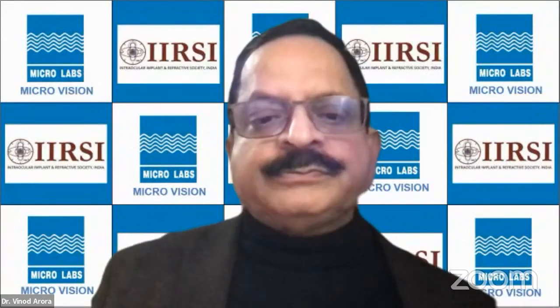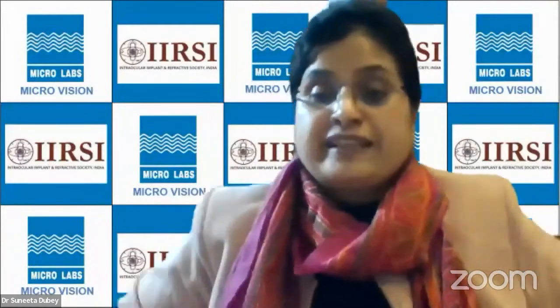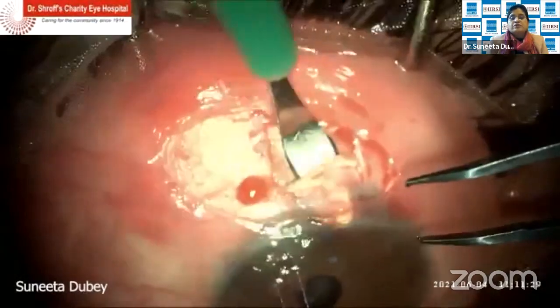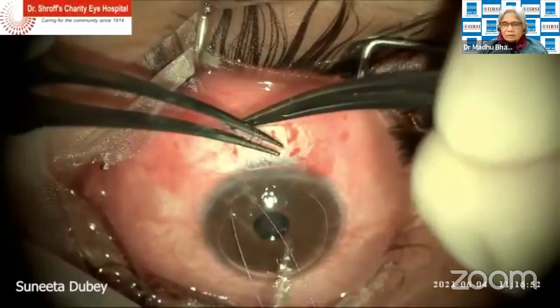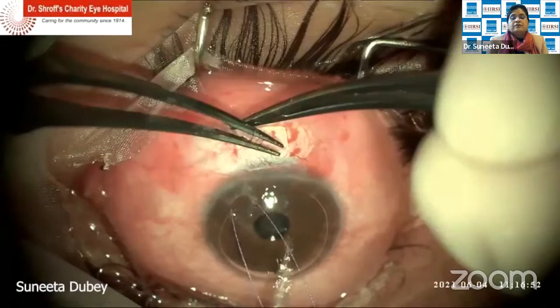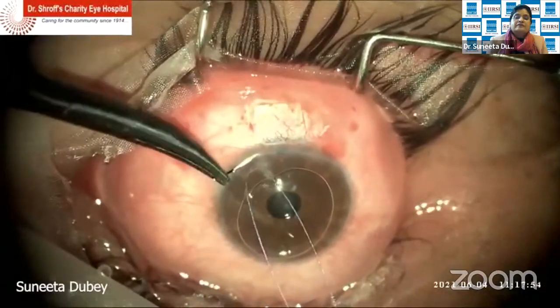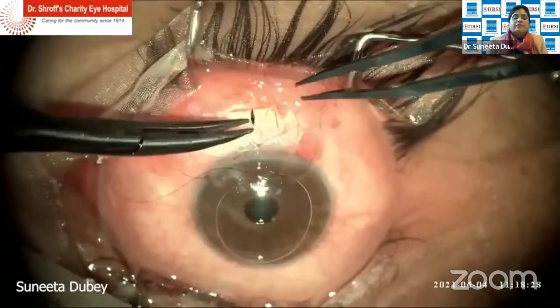We'll share that one. So now coming to the scleral flap suturing, I think that is the most important aspect again. What kind of sutures, and releasable sutures, and whether you prefer to use releasable sutures? At least one releasable for sure for every patient, otherwise 2 releasables. Yeah, so in this video also, I have used one fixed as well as one releasable suture, the Kolker's technique in the reverse direction, starting from the cornea and then going on to this.